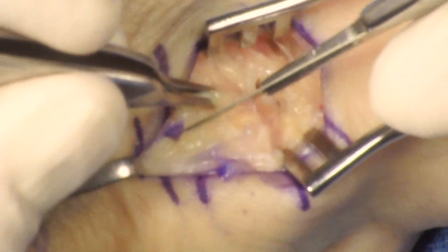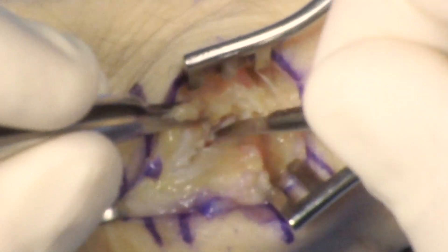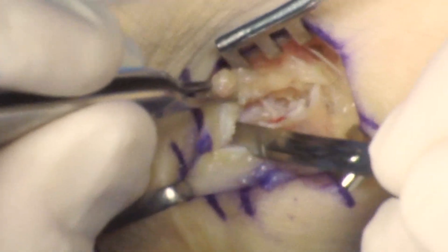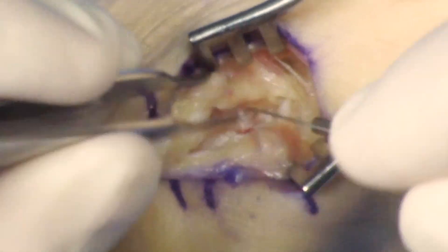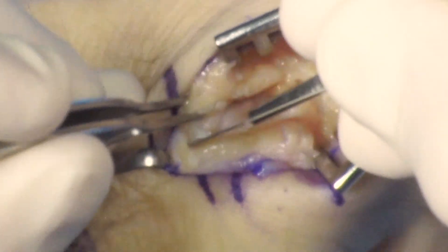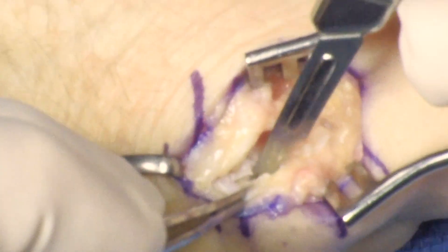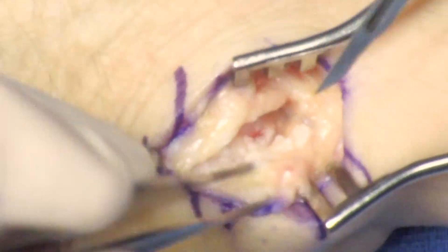Capsulotomy is performed, starting at the base of the first metacarpal and extending over the trapezium. Subperiosteal dissection of the trapezium is then performed. It's very important when removing the trapezium to get as many of the capsular attachments off the trapezium as possible. Attention is then taken to the radial side of the trapezium and the capsule is elevated.